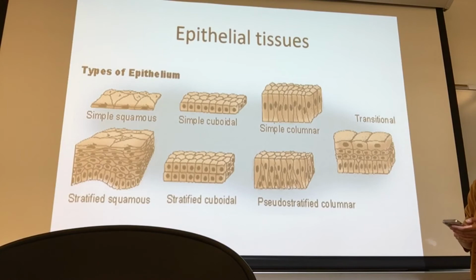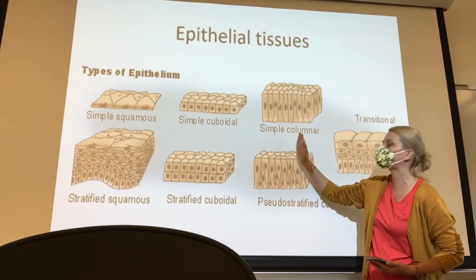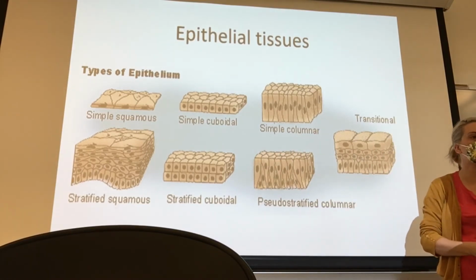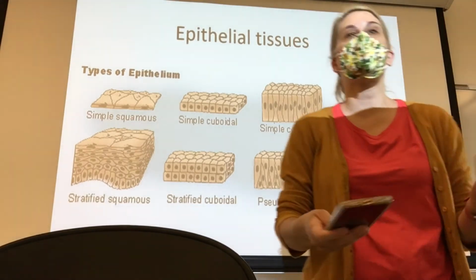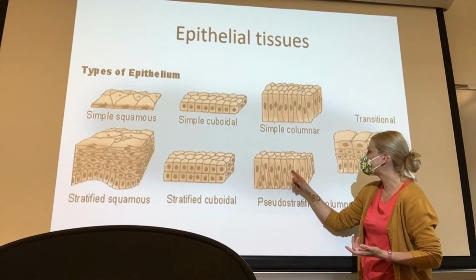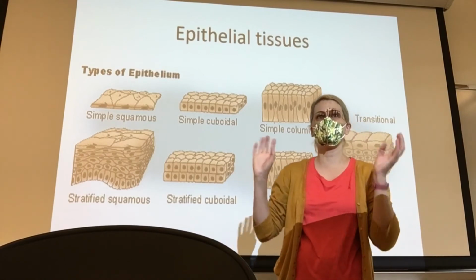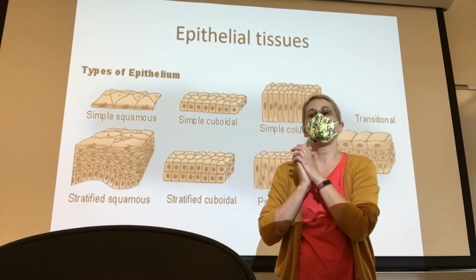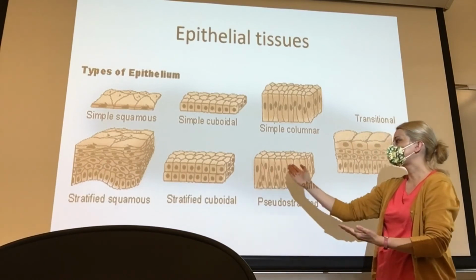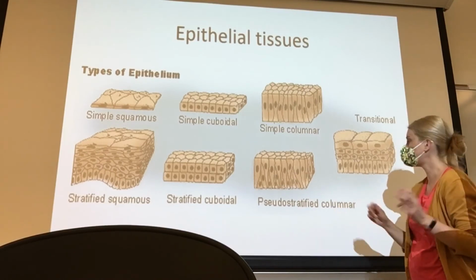The pseudostratified columnar cells, you can see they're kind of swimming between their layers, right? And so what this is doing is pushing specific apical surfaces of cells to the top, usually delivering their payload, like mucus is our example right now. And then these cells right here, they're further back towards the basal layer. Maybe they're developing. Maybe they're still working up their goblet droplets, okay? But see how they're not super orderly? That's the difference. Still stratified. There's some on the bottom, some on the top, but they're kind of not stratified well.